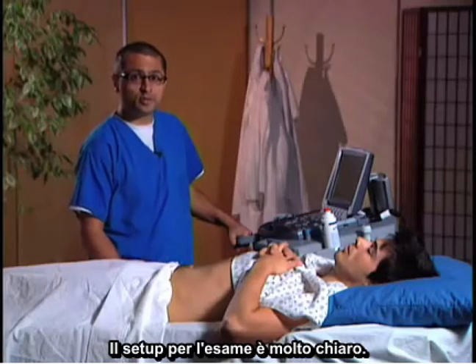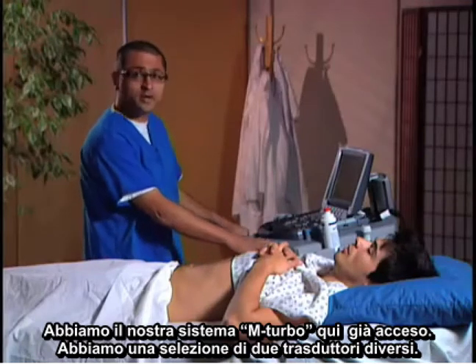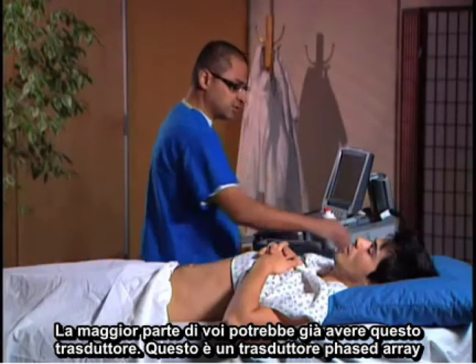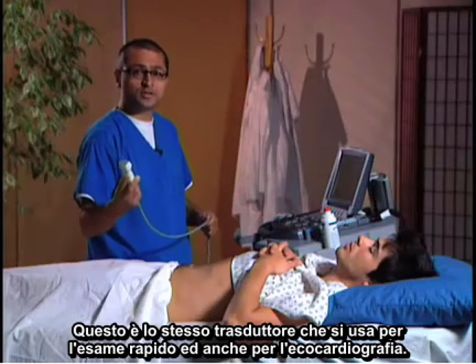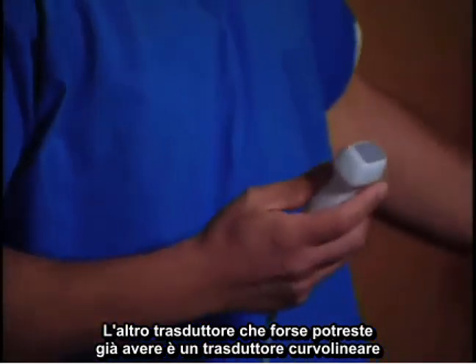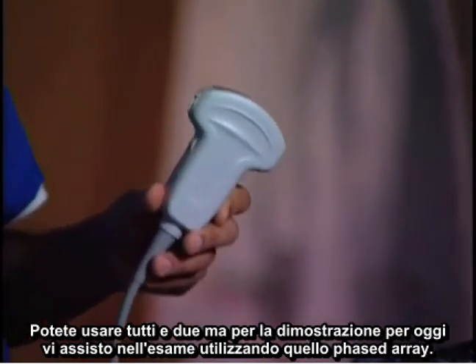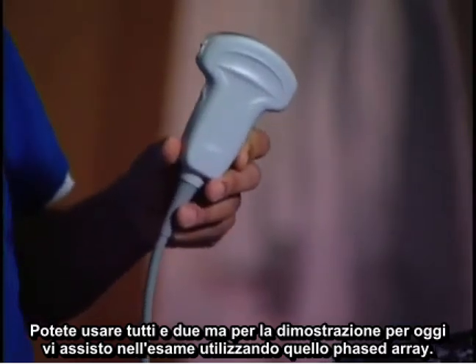The exam setup is very straightforward. We have an M-Turbo system here, already powered up and on. We have a selection of two different transducers. Most of you may already have this phased array transducer — this is the same transducer you're going to use for the FAST exam and for echocardiography. The other transducer you may also have is a curvilinear transducer, which is excellent, though you'll sometimes have problems with rib shadows. You can use either one, but for today's demonstration I'm going to take you through the phased array.